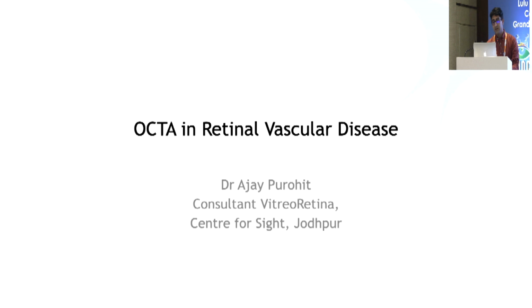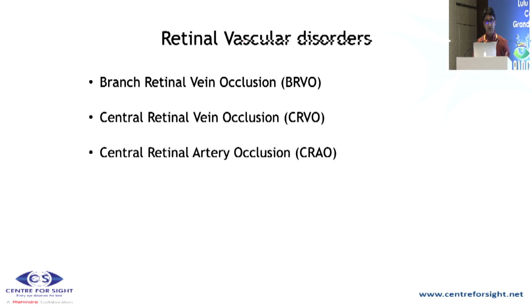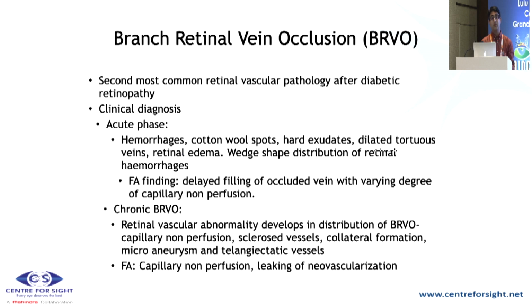Good afternoon, everyone. I would like to thank AVNINDRA sir for giving me this opportunity. I will be discussing retinal vascular disorders. Diabetic retinopathy has already been discussed. I'll be touching mostly on BRVO, CRVO, and a few cases of PAMM and optic nerve head. These are the cases which we usually see in OPD, and I'm mainly concentrating on BRVO because it's the second most common retinal vascular disorder after diabetic retinopathy.